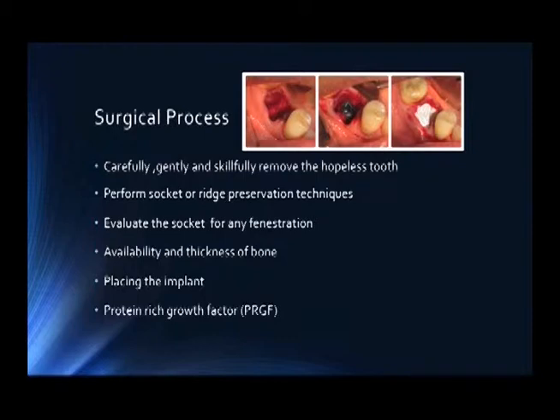Some doctors might also use PRGF, which is protein-rich growth factor, which is actually from your client's own blood, and may be harvested and utilized to mix with bone grafting material to aid in healing and quality of healing and the speed of healing. So if the surgical doctor that you deal with does that, you should learn more about that process so that you can thoroughly explain and discuss that with your client.